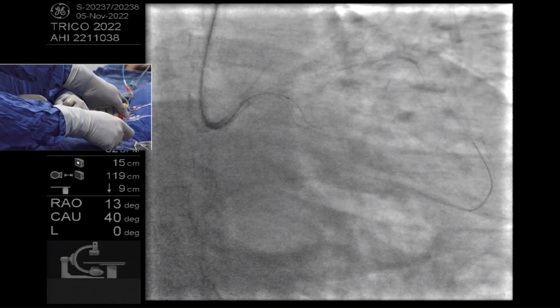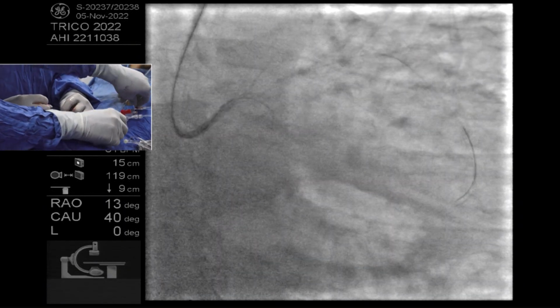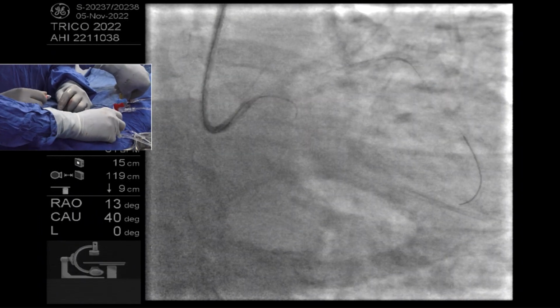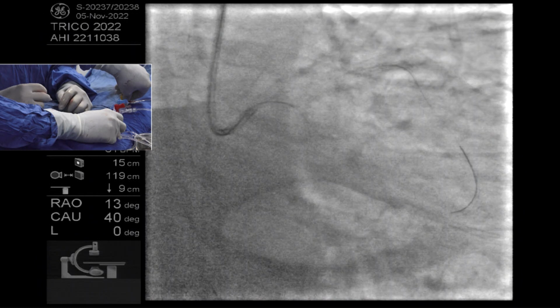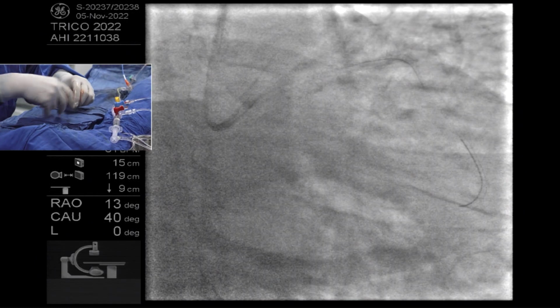This proximal curve can be straightened by putting a wire and also a balloon across the distal LCx, and then possibly we can try the OM. Bend more.